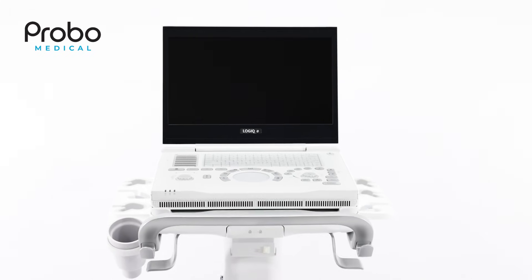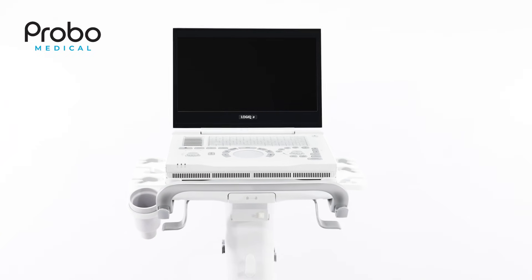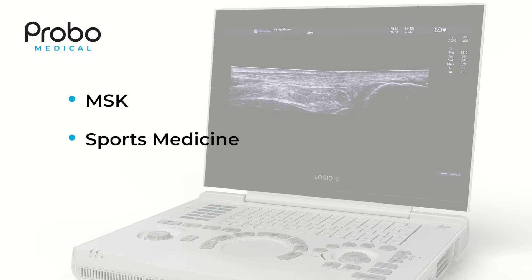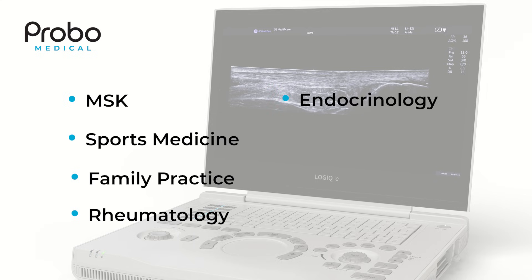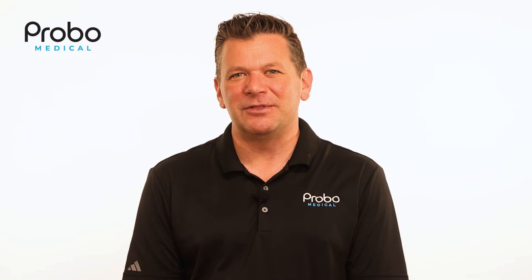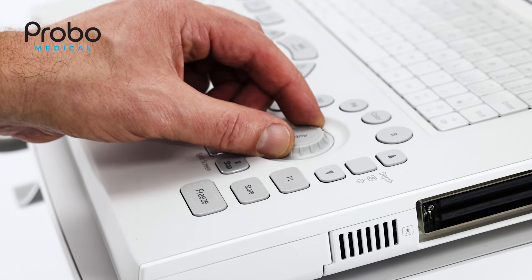The trackpad was added based on feedback from the primary care market this machine was designed for. This includes MSK, sports medicine, family practice, rheumatology, endocrinology, private vein and vascular clinics, and internal medicine. GE Healthcare spent a lot of time with this market in developing the R9, and its updated features and user interface were designed accordingly.